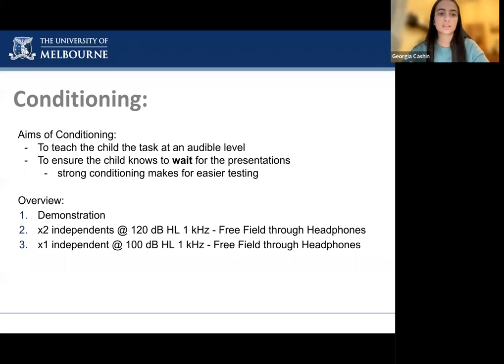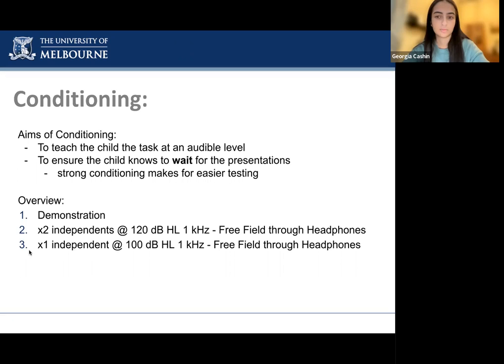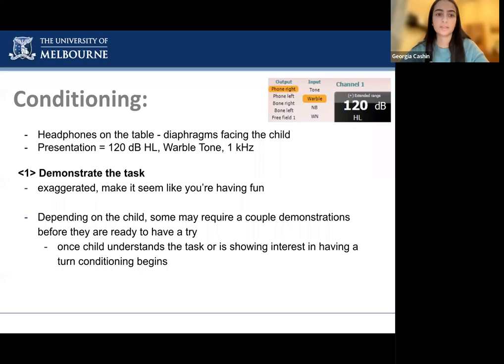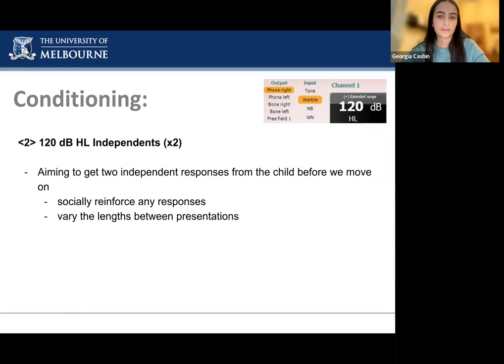The aim of conditioning is to teach the child the task at an audible level and ensure they know to wait for sounds to be presented. Strong conditioning makes it easier to get more results during testing. We begin by demonstrating the game with the headphones sitting on the table and the diaphragms facing outwards, starting at 120 decibels. The child may require a few demonstrations before they will do it by themselves, but once they understand the game or begin to reach for the game, we look for them to respond independently.